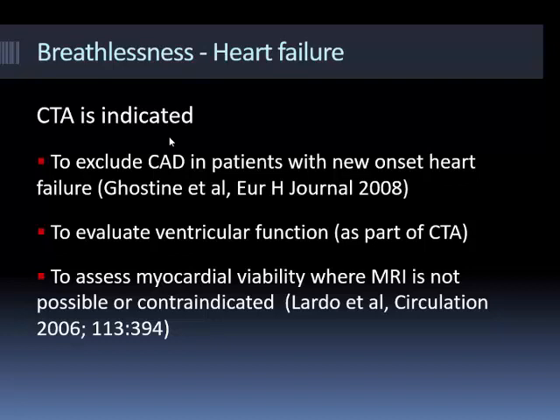Saying that, I think I did my best ever CT angiogram in somebody with severe heart failure and a heart rate of 90. I think mostly because his EF was about 5 or 10%. So even though he was tachycardic, the heart actually wasn't moving. So it was a good study.